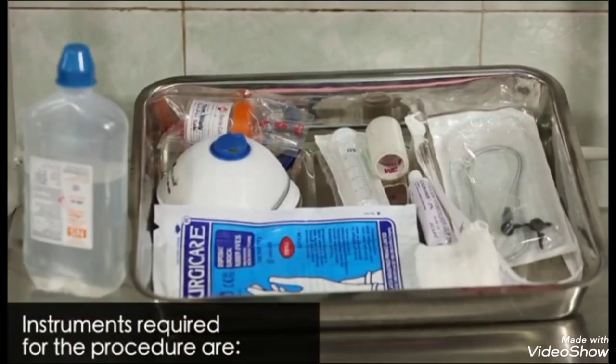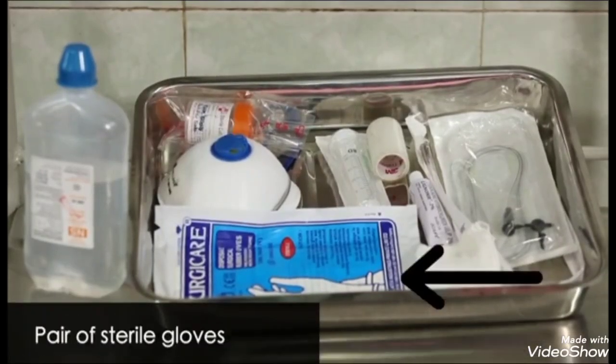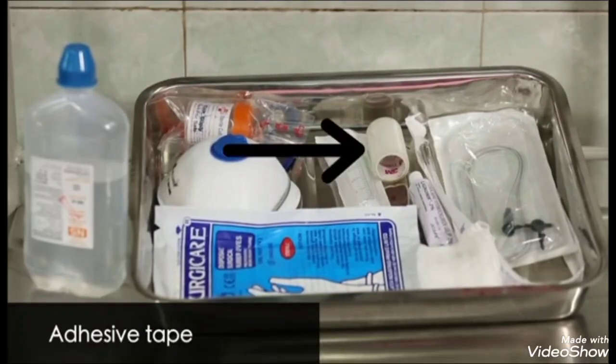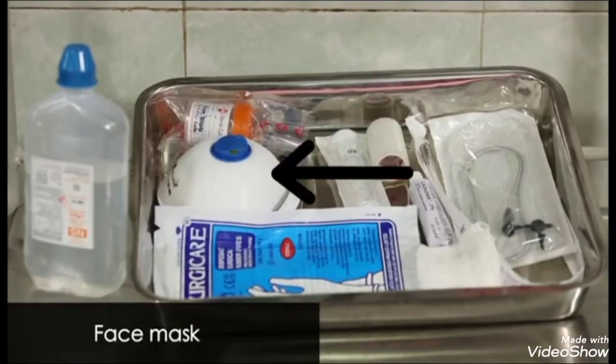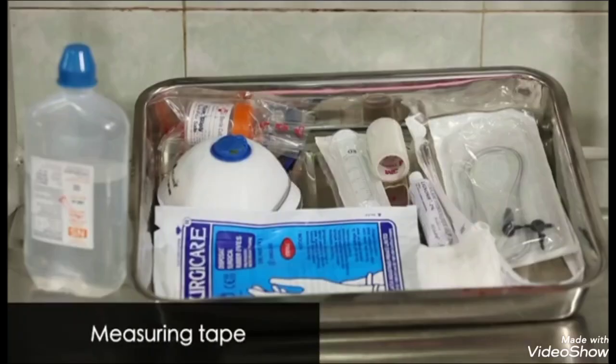Instruments required for the procedure are normal saline, pair of sterile gloves, Ryle's tube or infant feeding tube, adhesive tape, lubricant jelly, 5 ml syringe, sterile specimen container, face mask, sterile gauze, and measuring tape.